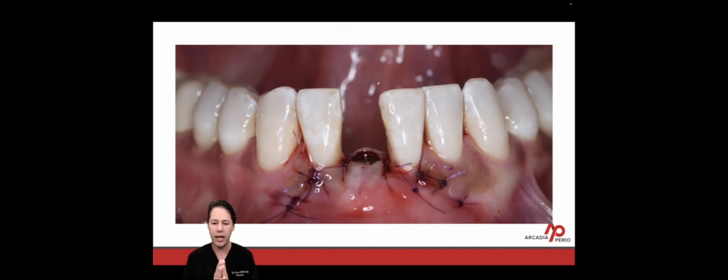Here we have everything closed up. A little bit more bone grafting was done at the time of placement with a membrane. And this is going to be my 5-0 Glycolon sutures. Everything is closed up very nicely in this case. Knowing that I had to graft is why I went one tooth on either side of the implant itself.